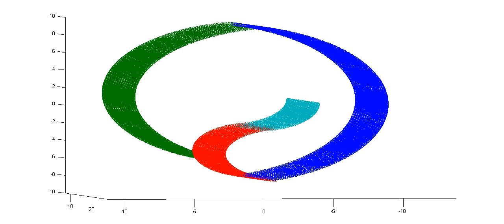And then also the fact that blood vessels are the things that cause the blood oxygenation level, and blood vessels might be larger than voxels in some cases. So you might see a correlation across multiple neighboring voxels, but it's because there's a large blood vessel that is essentially the cause of both of those neighboring voxels reflecting some signal. So it's not as though you can get down to an arbitrarily high level of precision.